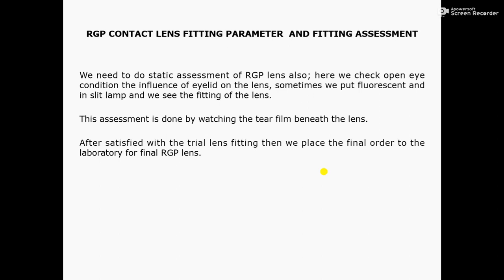After being satisfied with the trial contact lens fitting, we place the final order to the laboratory for the final RGP contact lens. Thank you.